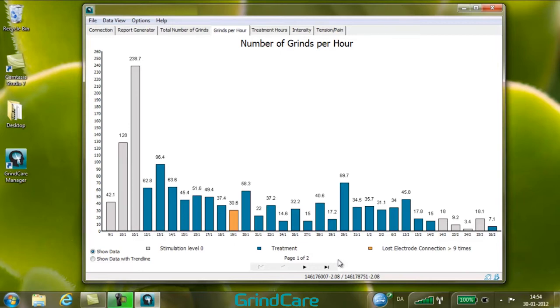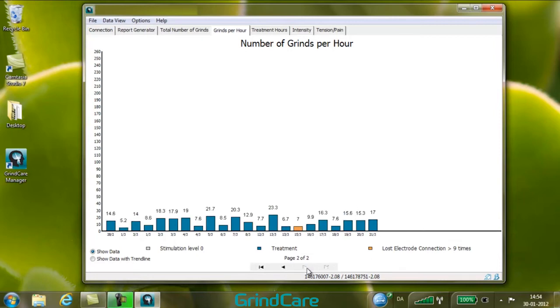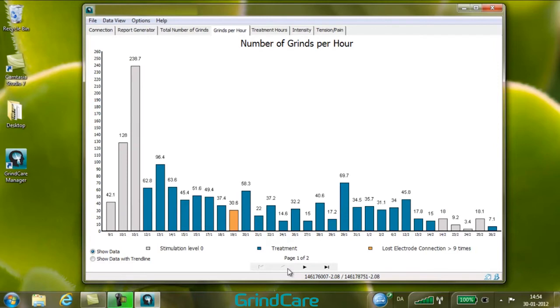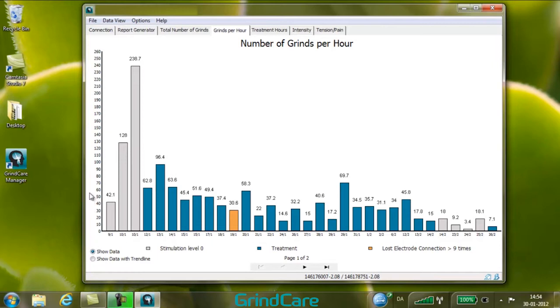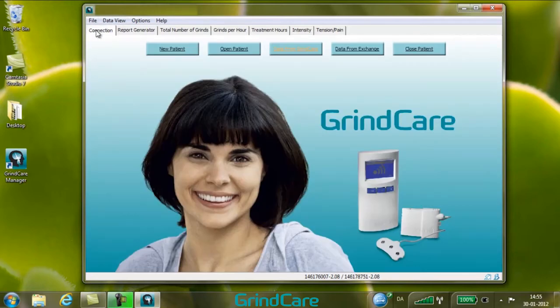The page buttons at the bottom of the screen allow you to navigate between pages in the displayed patient file. Click the radio buttons at the bottom left to select whether data is shown with or without a trend line.